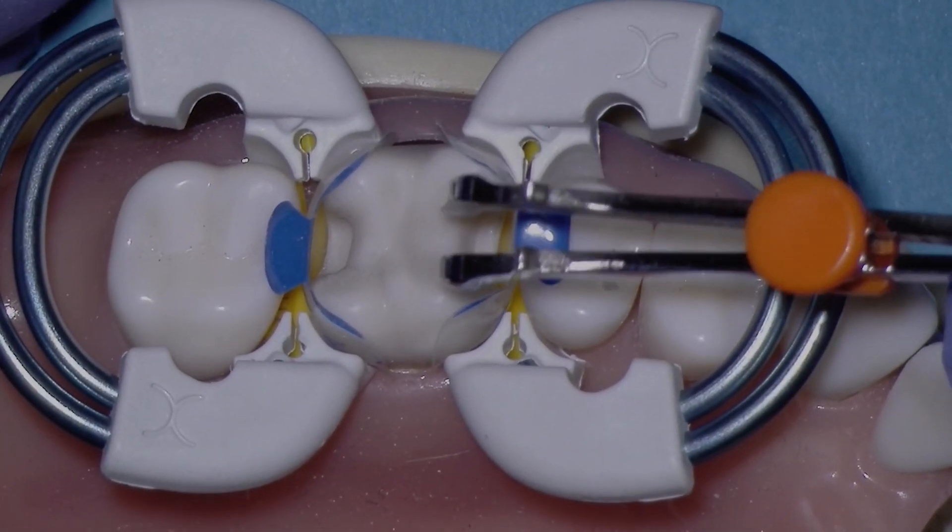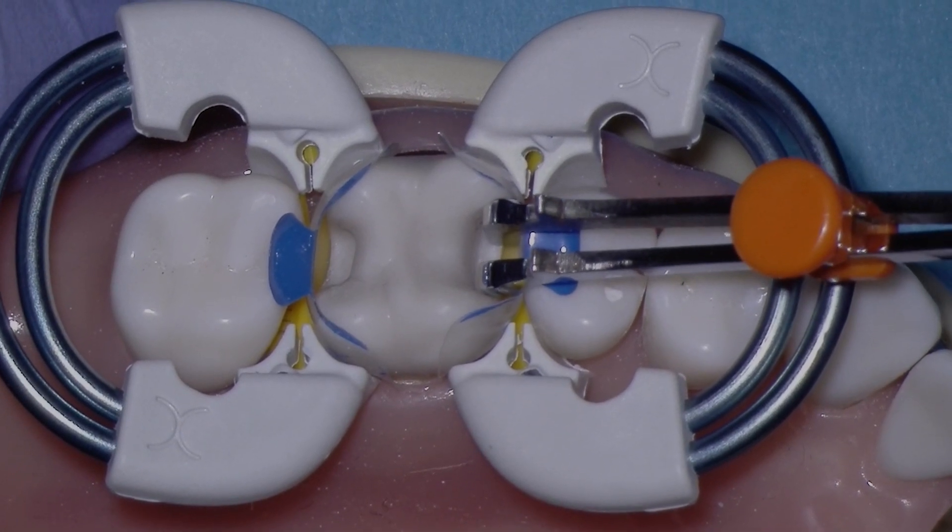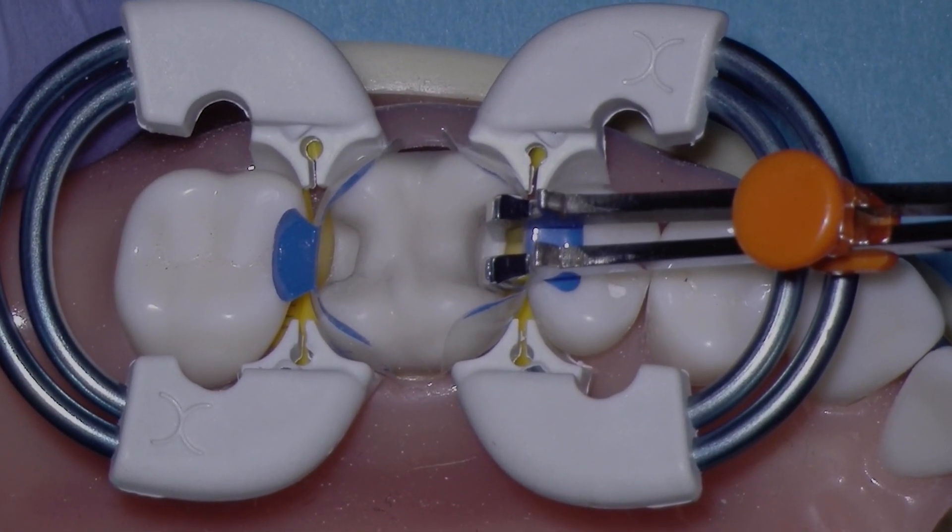I'm dropping the instrument in and pulling the matrix over. That's using the pulling motion to approximate the matrix on the mesial.